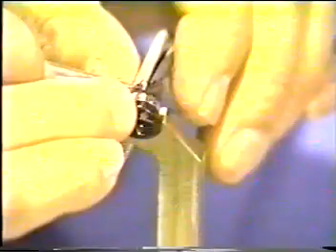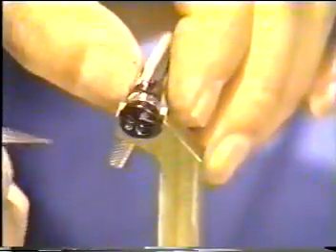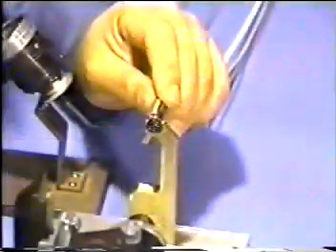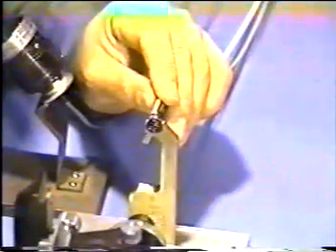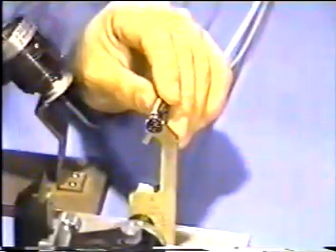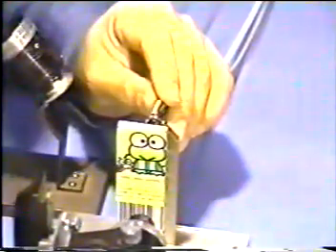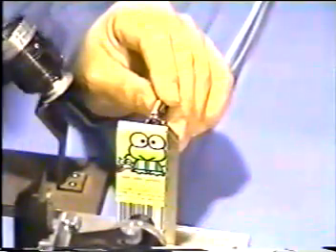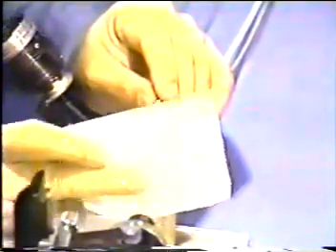In case of UGIFP7, screw hole portion of DEL should be placed against LG. Each scope has its specified focusing adjustment method. Fasten DEL tentatively. Looking into J60064, rotate the IG to obtain the erected image. Check for dirt and dust on the end of IG.